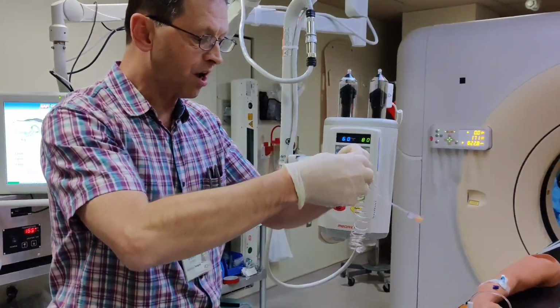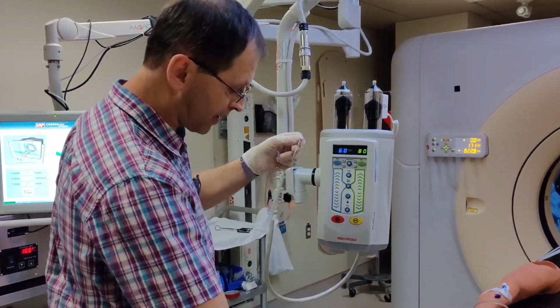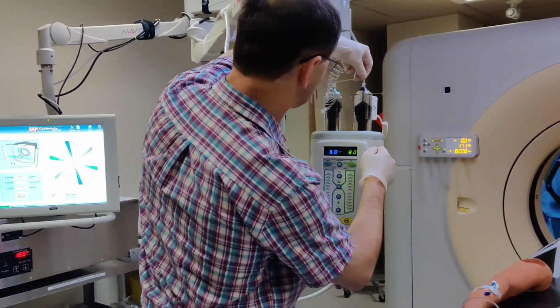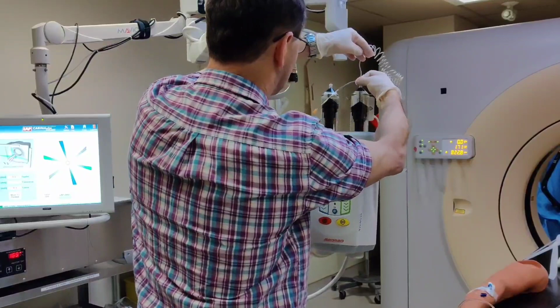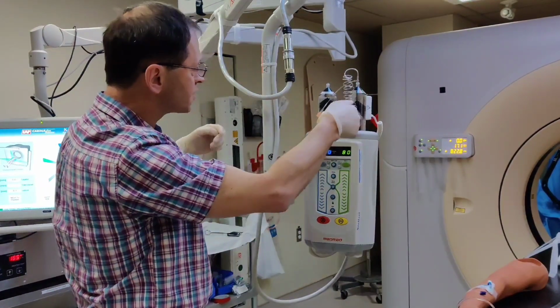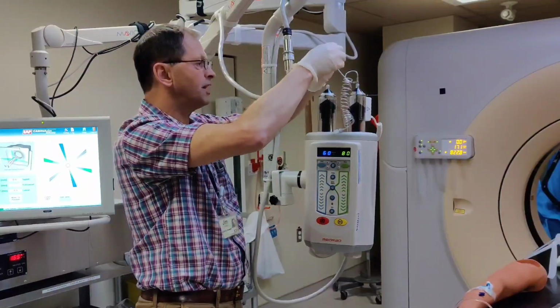Like, carefully take this off. It should be sterile. If I make any contact, I should wipe it down, and I'm going to attach this. Let's give it a twirl. There we go. So I've got the contrast side. I'm going to do a similar thing now. Again, being cautious not to contaminate anything.